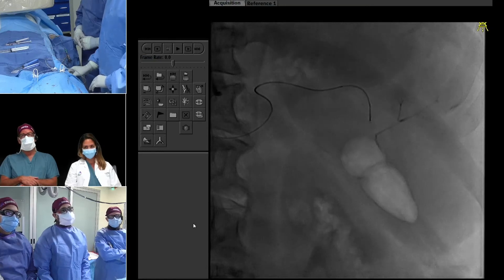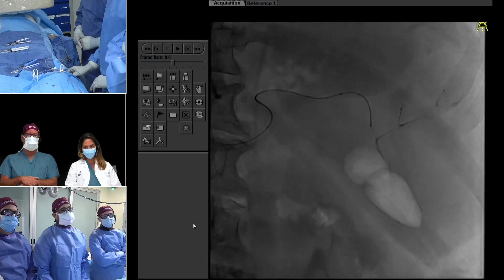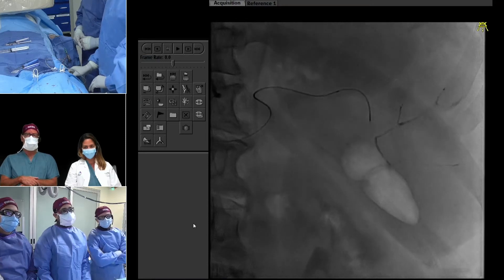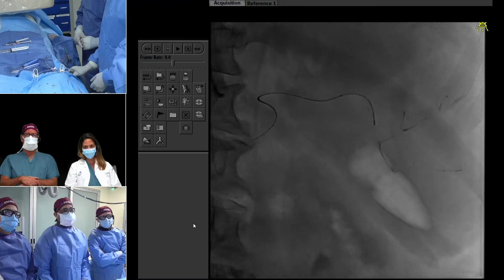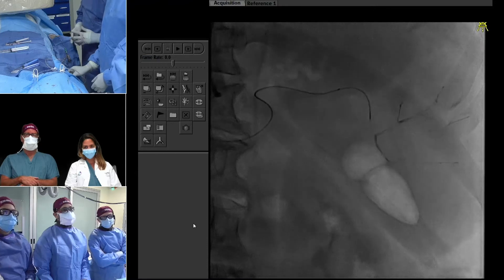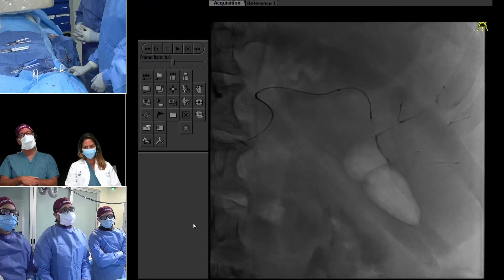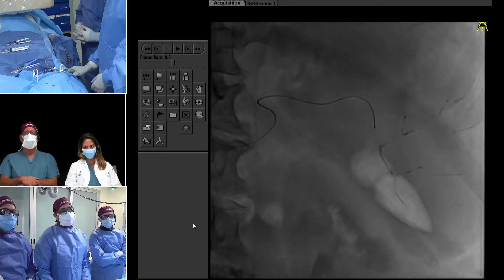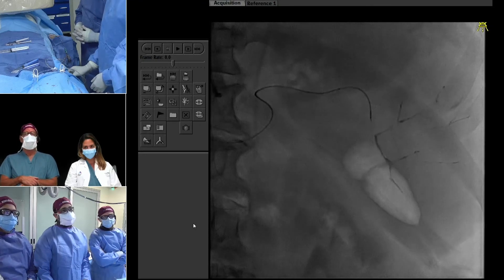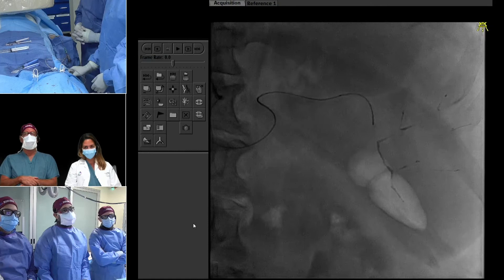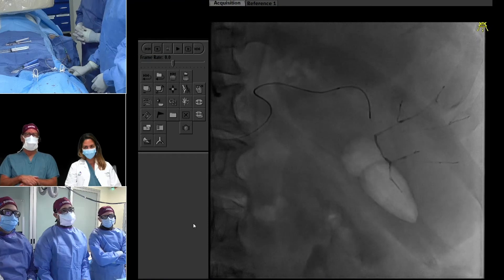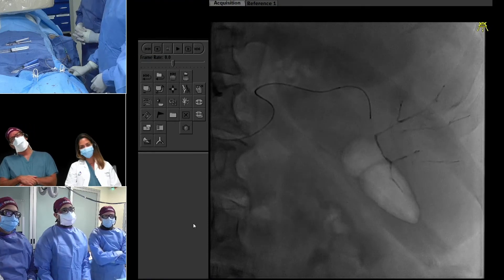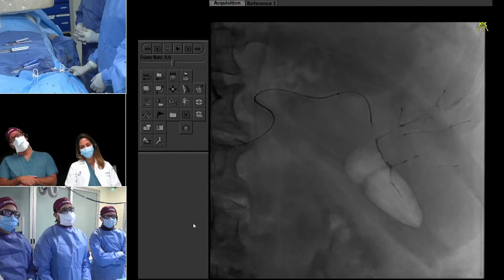Here you can see the Onyx start to come out. Going very, very slowly, trying to push it distally. This is Onyx 18 — probably could have gotten away with 34 just given where we are, but I already drew up the 18. We'll do this branch, and then come back and try the next one — I think there's one more branch we want to hit.